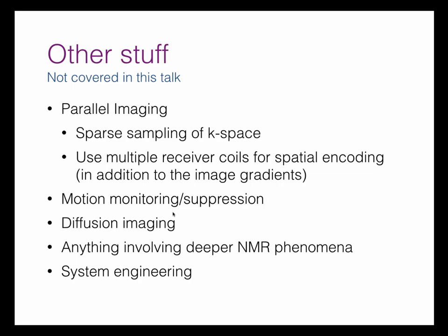If you're collecting a time series of data, it's happening now, you have to get the data now, and you're stuck with what you get a lot of the time. But in principle, if you've got plenty of time, say you're acquiring an anatomical scan, you can make these measurements and reorder some of the scans. Or, if you've got respiratory motion, you can gate to the ECG or the respiratory signal, or both, and try to suppress some of these motion effects that way.